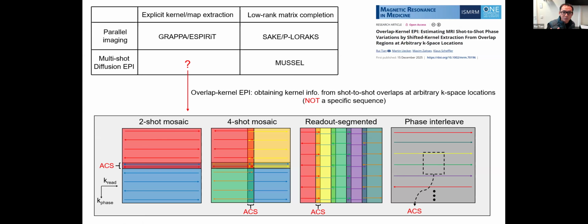So that is also one reason that in the phase interleave, we implement our method but only look at a central k-space region, like 50 times 50. If you enlarge these regions, we didn't empirically find any advantage by increasing it to 70 times 70. I think the result is very similar. But if you increase to everywhere, like incorporating the most outer ring of the k-space, I think it will induce some data that's not really useful. So this is still a theoretical guess.